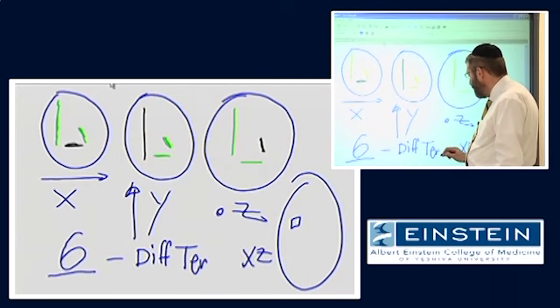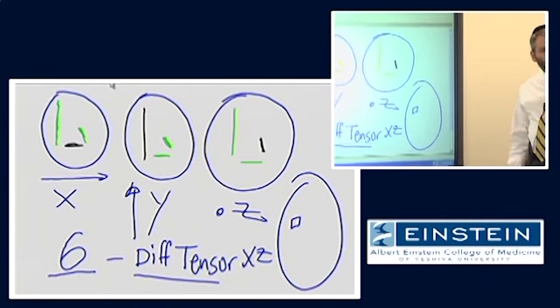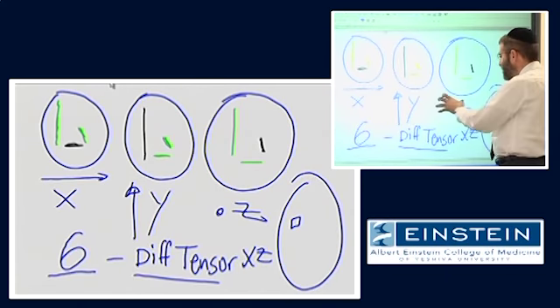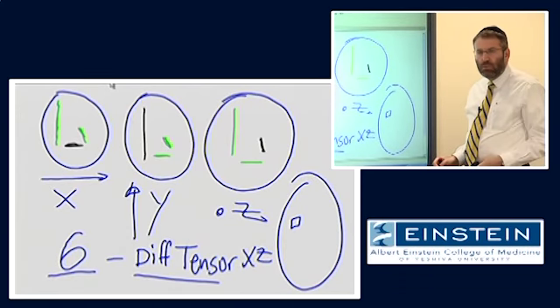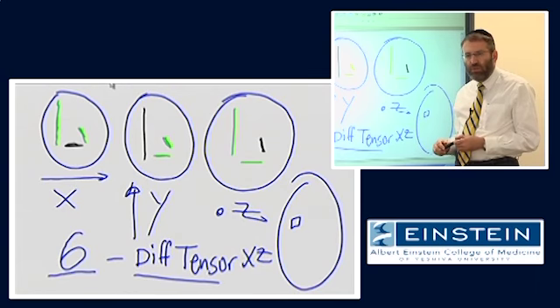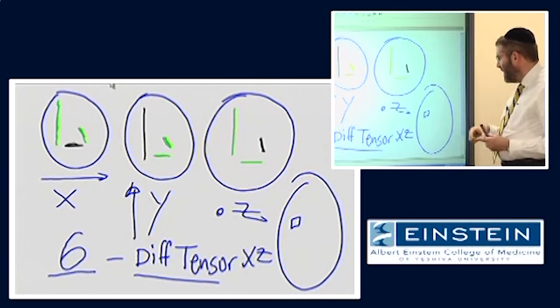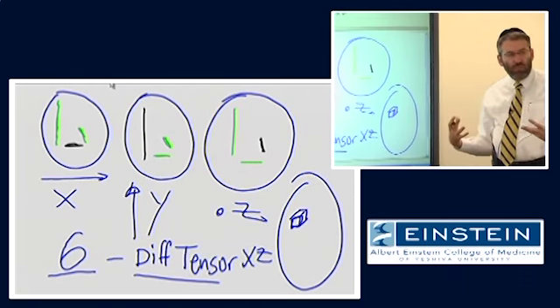We can potentially do an even better job the more different directions along which we sensitize to diffusion. But keep in mind that each additional direction requires a complete iteration of the entire process. Now, this is echoplanar imaging, so they don't take that long to acquire. But the more unique directions along which we sensitize to diffusion, the longer it's going to take us to do that. Now, we're making these measurements at a voxel in the tissue, which contains many protons.